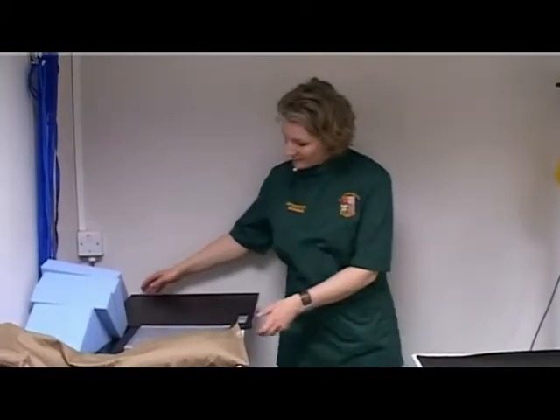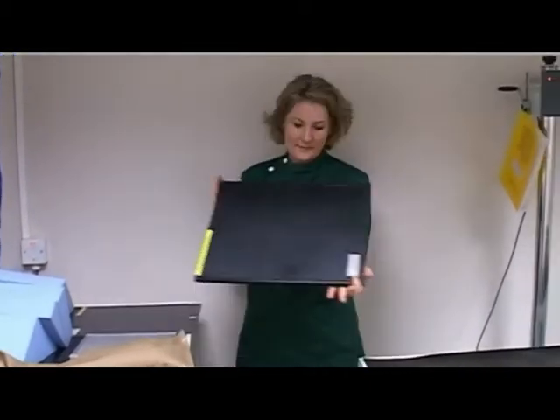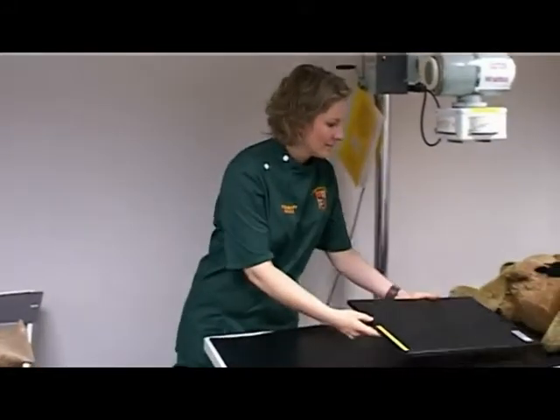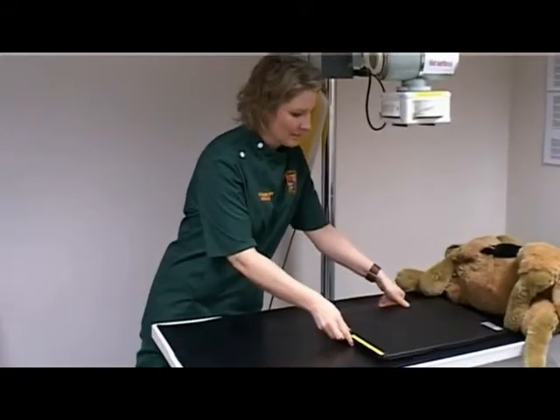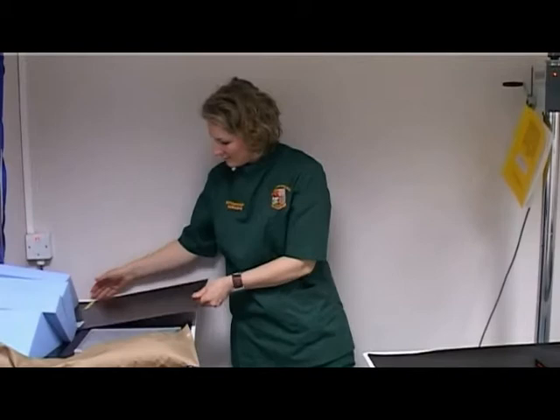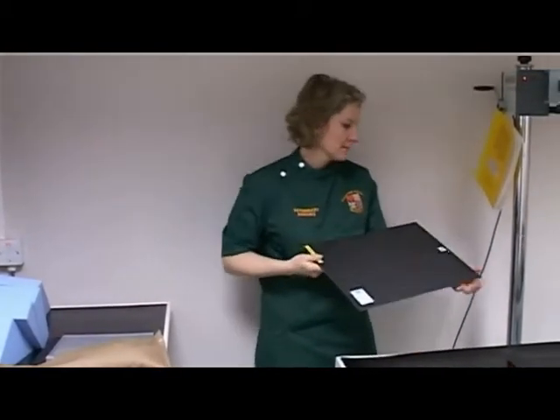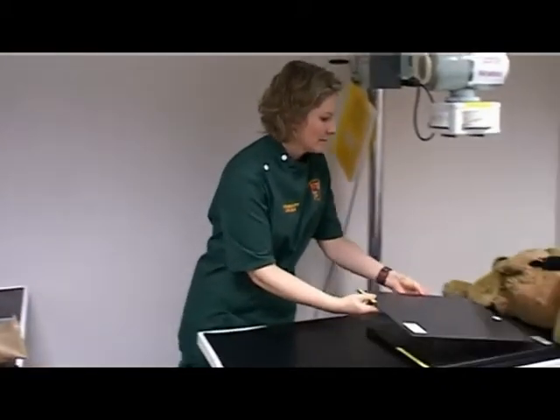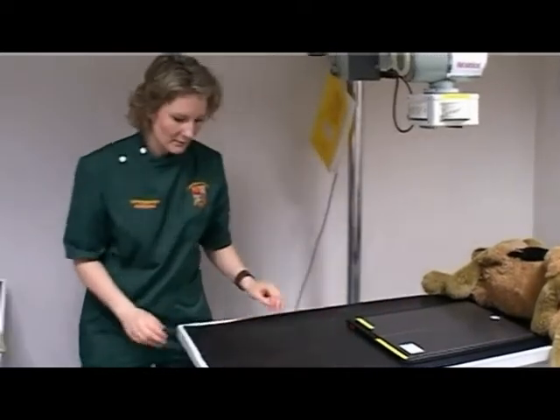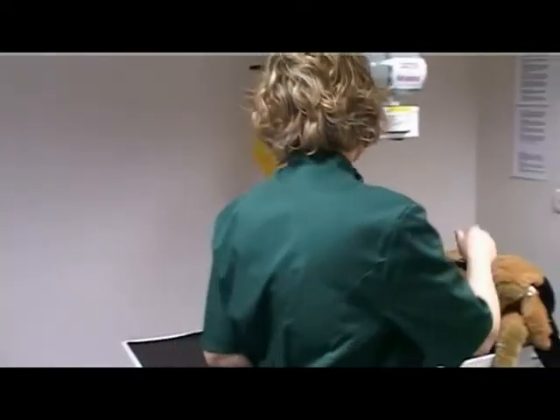Select a large sized cassette and place it the correct way up on the table. Select an appropriate size stationary grid and place it exactly on top of the cassette, ensuring it is the correct way up. Collimate to within the edges of the grid.